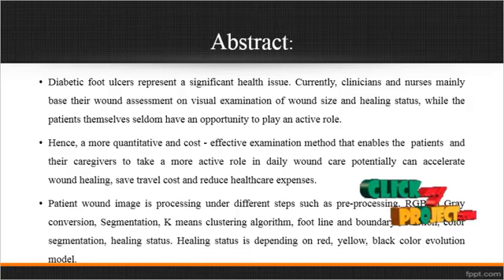Currently, clinicians and nurses mainly base their wound assessment on visual examination of wound size and healing status, while the patients themselves seldom have an opportunity to play an active role.